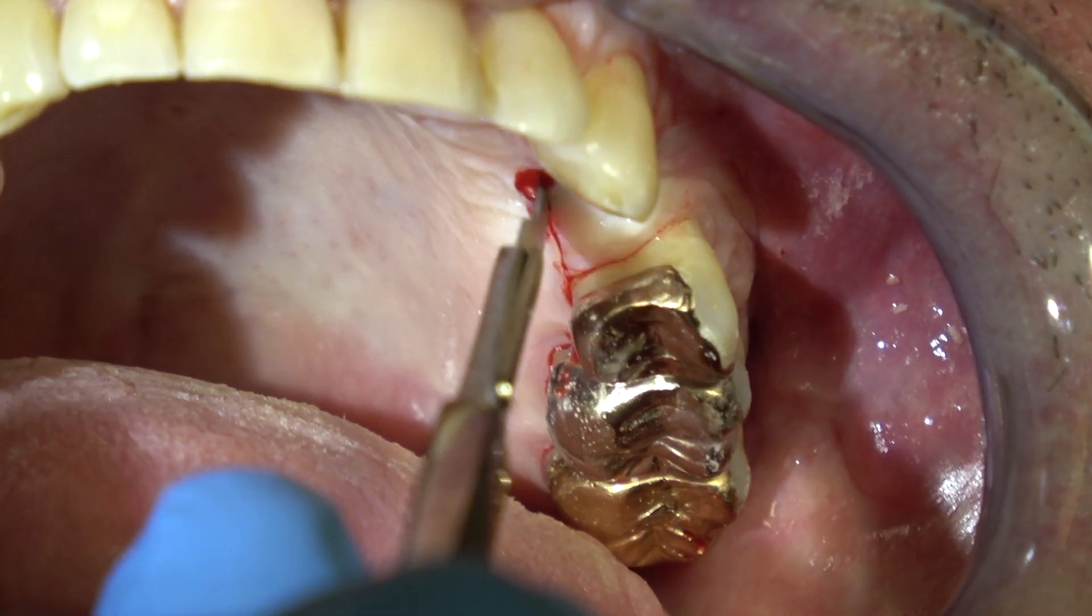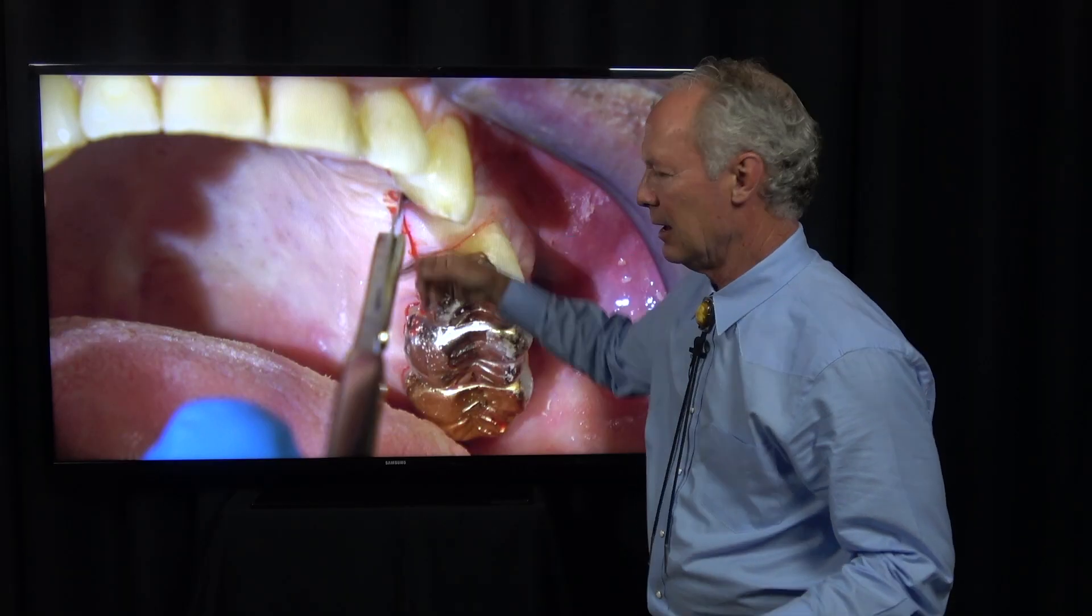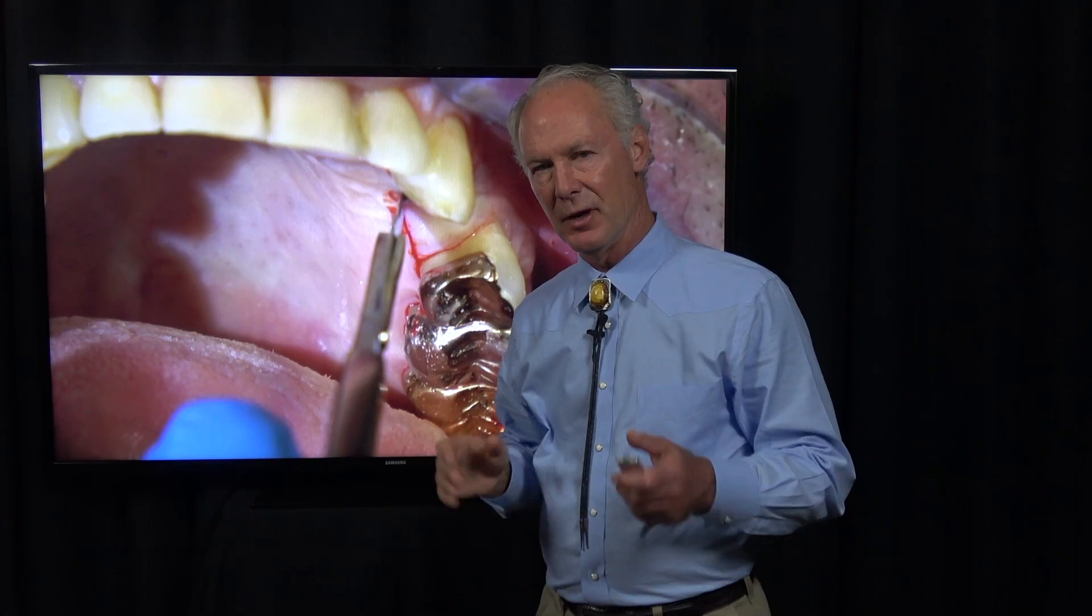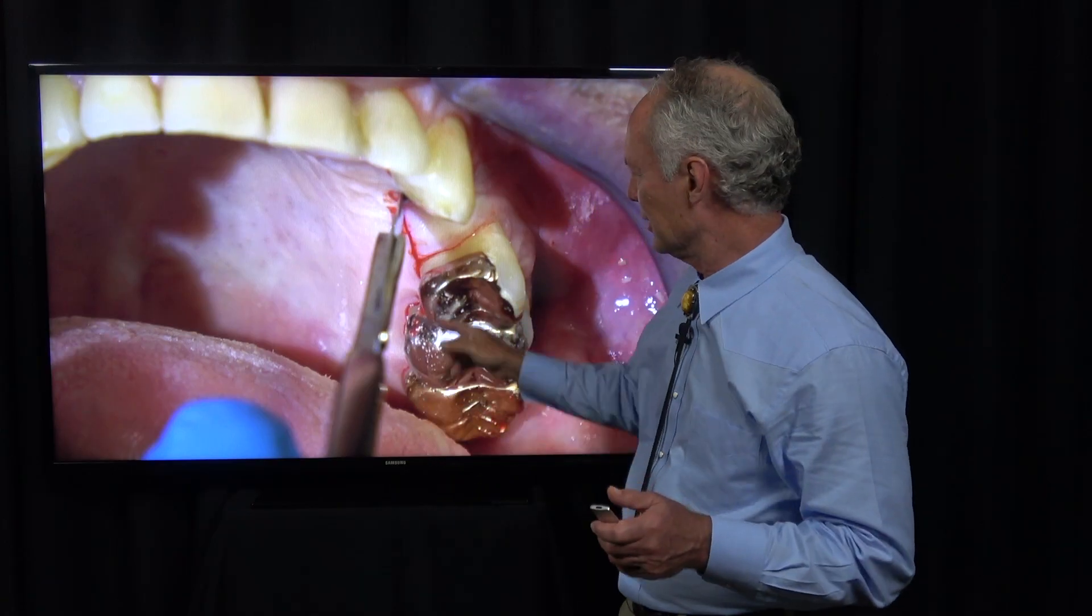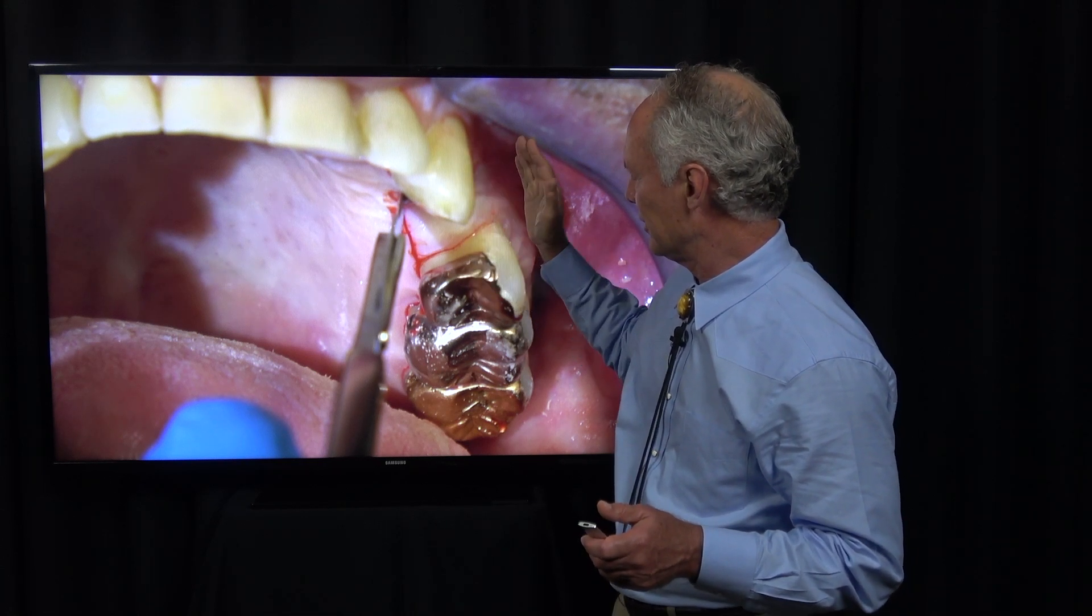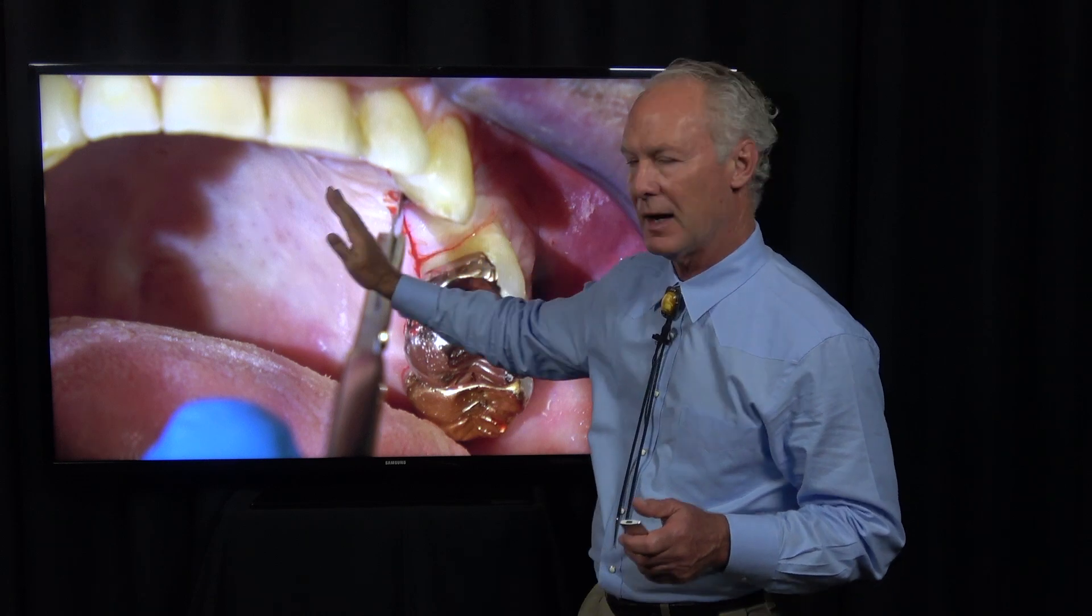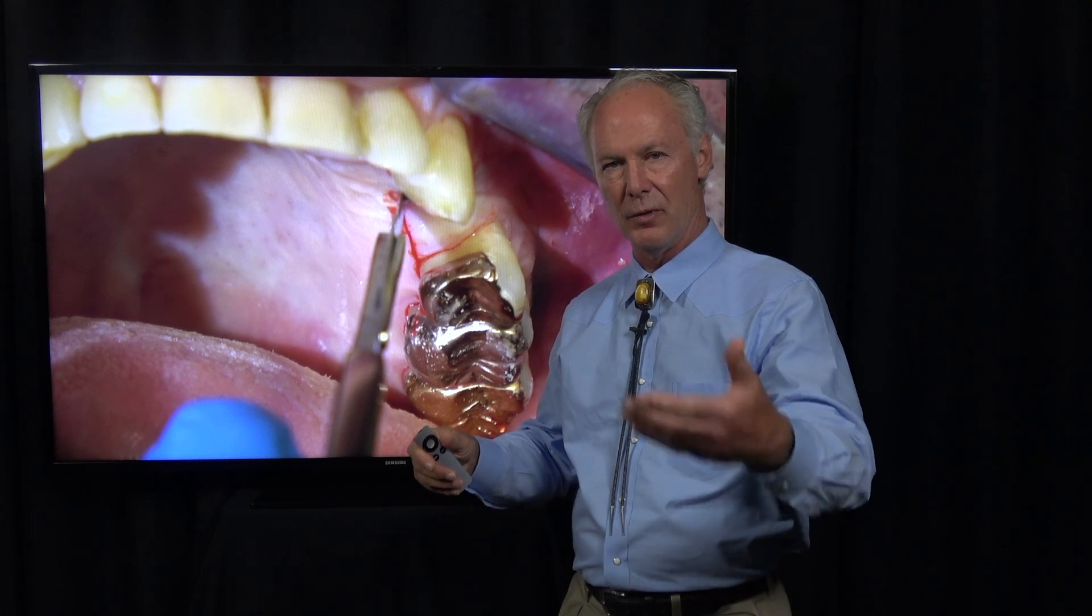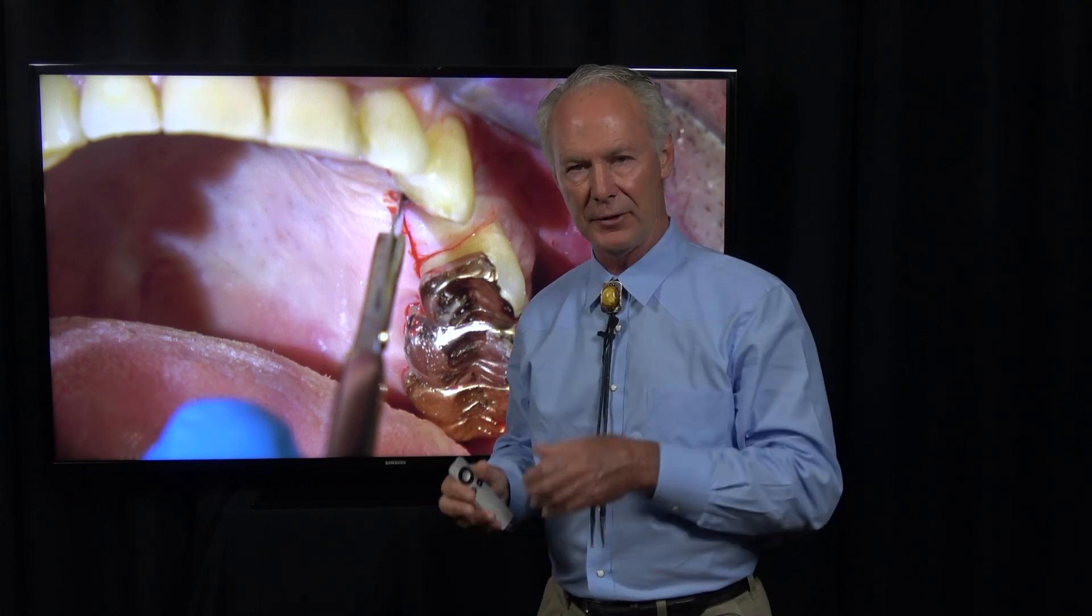Make your incision on the palatal side. In the maxilla, you always want to reflect the flap toward you, toward the facial. Never make the incision down the center of the edentulous area. You don't want a palatal flap and a facial flap because you'd have to retract both. You just want one flap coming toward the facial.